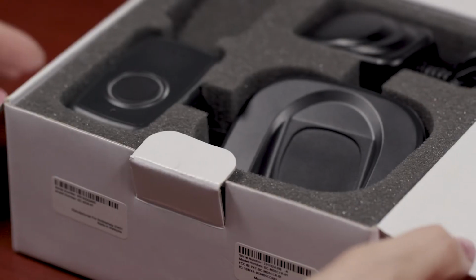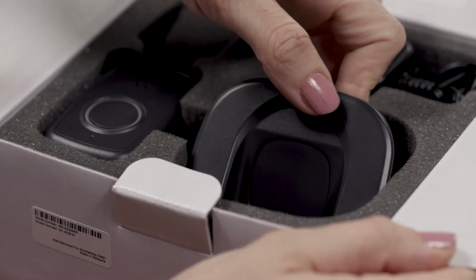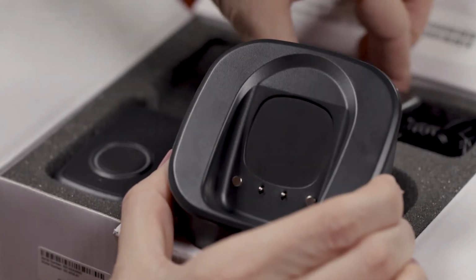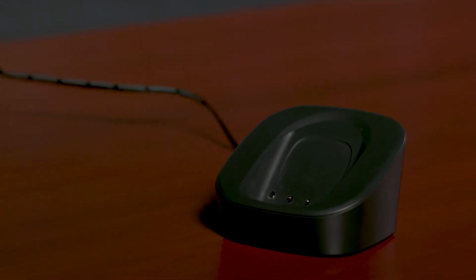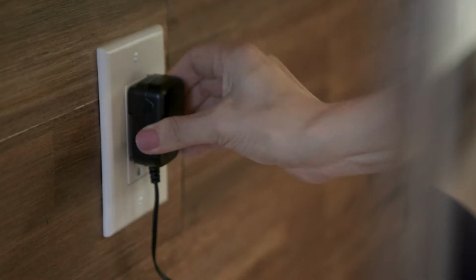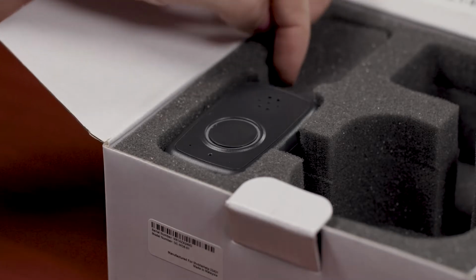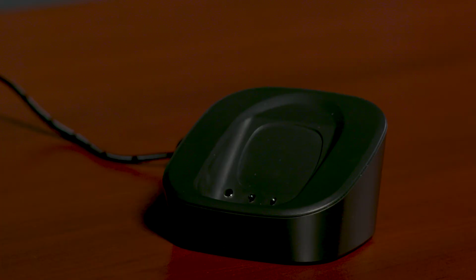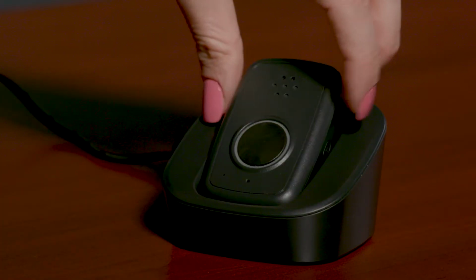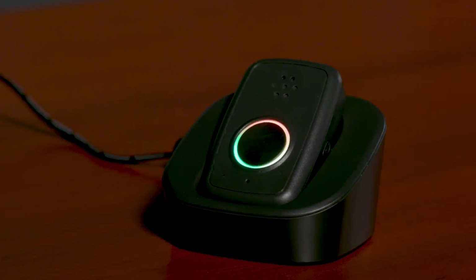Inside the box, you will find a cradle charger. Plug this into an electrical outlet, making sure that the outlet is not controlled by a light switch. Also inside the box is your micro. When you place the micro on the cradle charger, it will automatically turn on and begin charging.